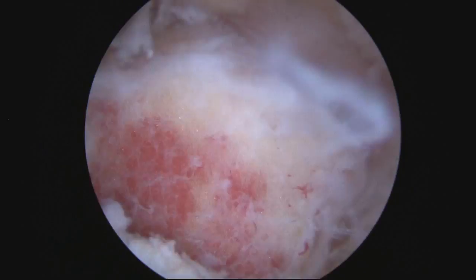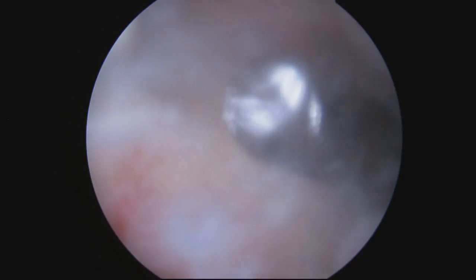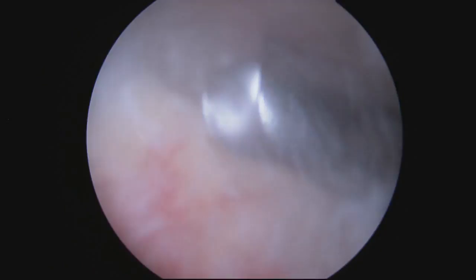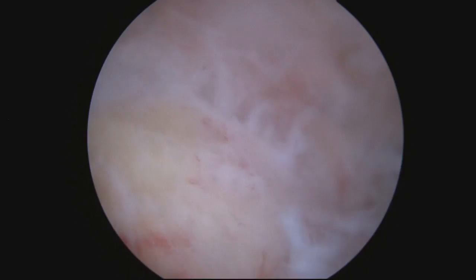Once I've taken off the bottom part of the clavicle, I'll just move upwards. I want to create a nice, smooth resection — taking enough so that the bones no longer impinge and cause pain.